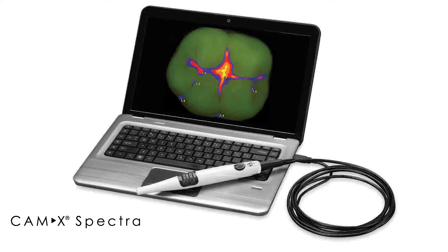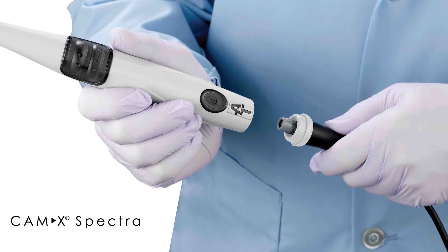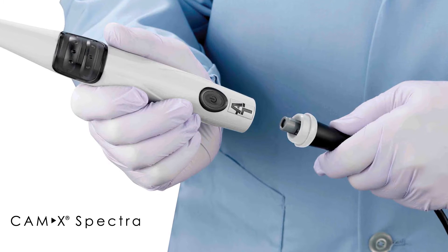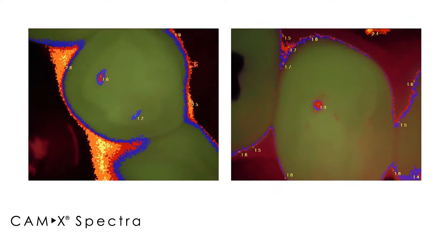Spectra is a device that helps you detect cavities within the patient's mouth. There are many benefits of this device for the dentist. One is that you can show the patient what is actually happening in their mouth and allow them to take ownership of the situation.